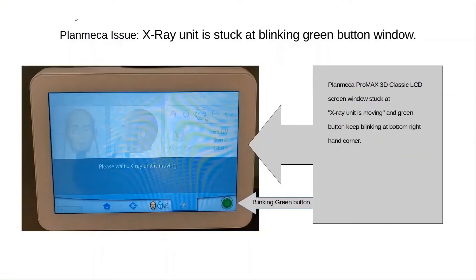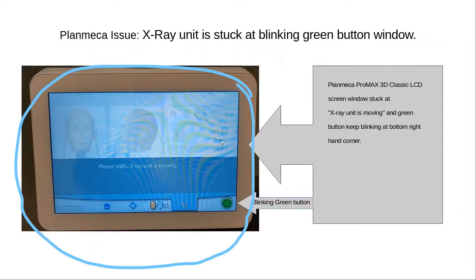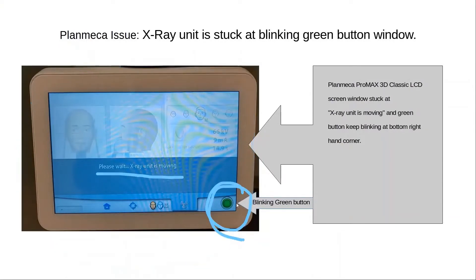If you are a Planemaker Pro Max 3D Classic X-ray Machine user and you are faced with an issue where you see a screen which says 'Please wait, X-ray unit is moving,' and you see a button at the bottom which keeps blinking and does not move forward, then this video is for you.